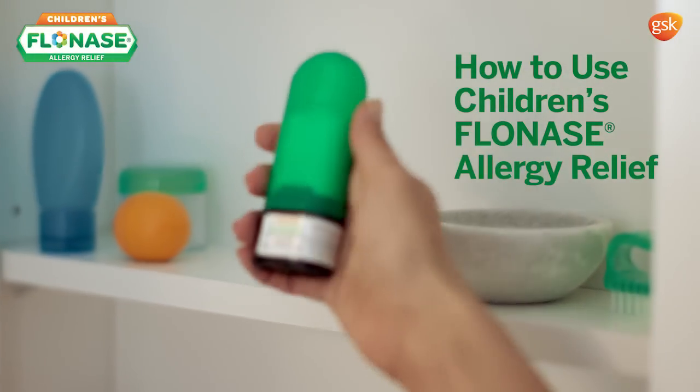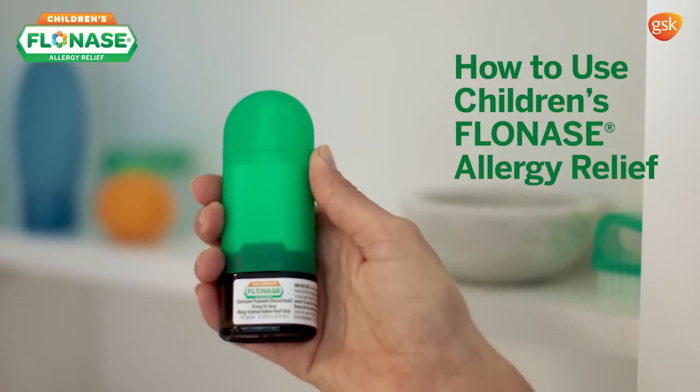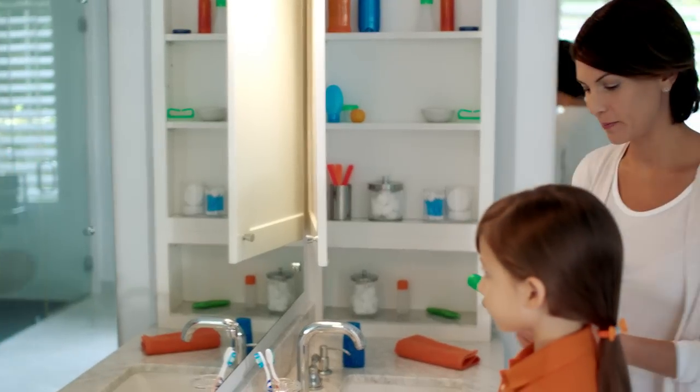It's easy to use Children's Flonase Allergy Relief. Just follow these simple steps so your child gets the most from each spray.